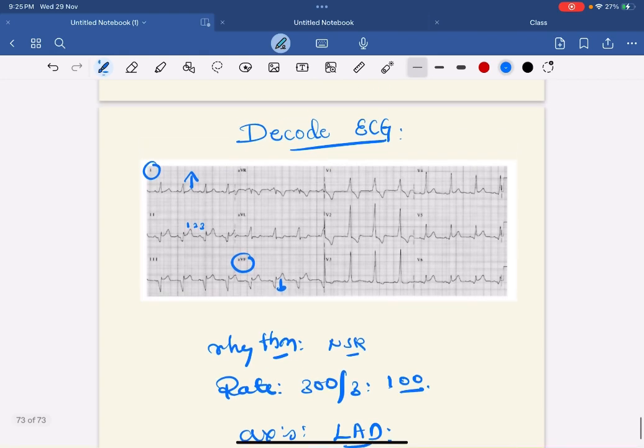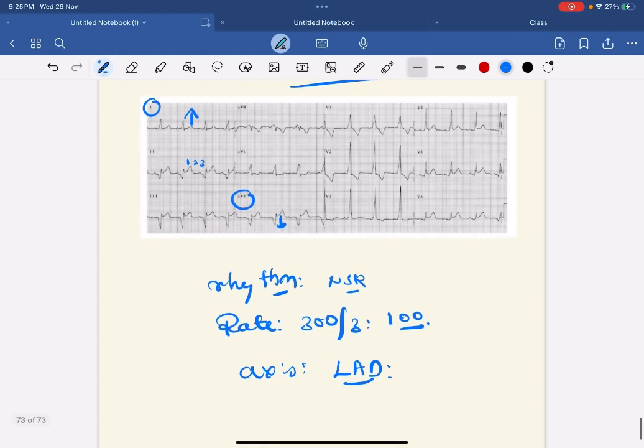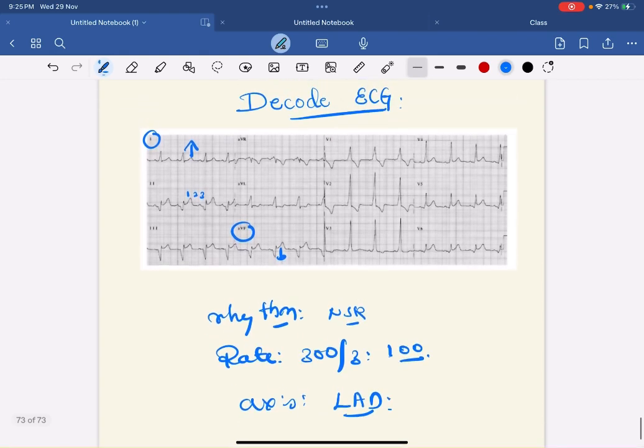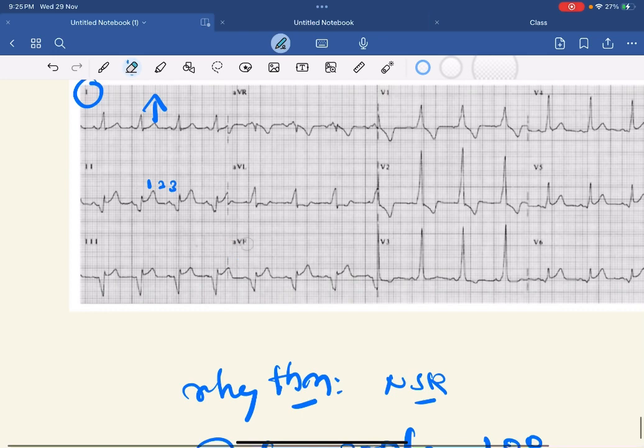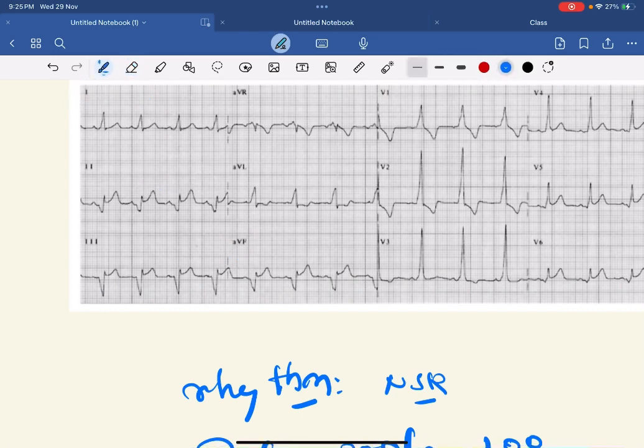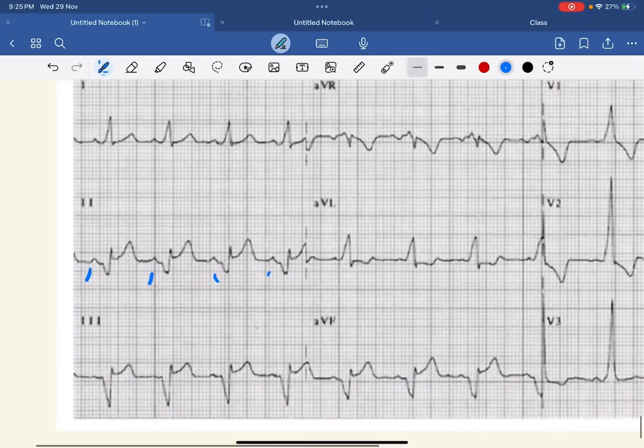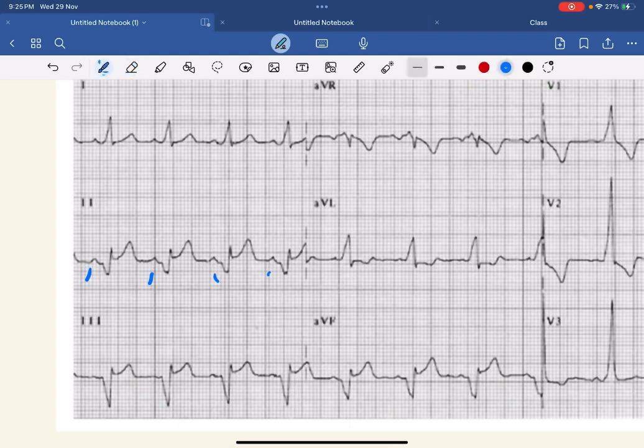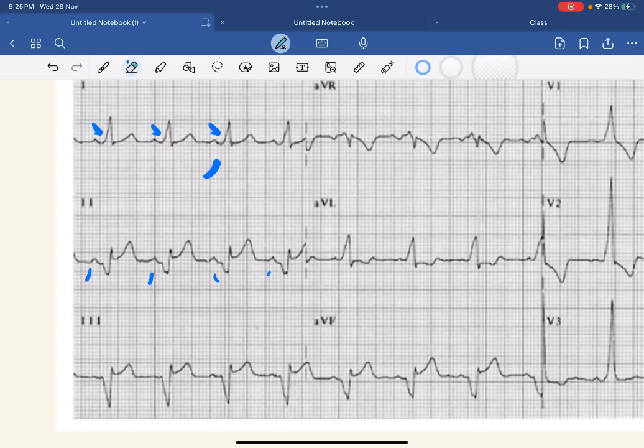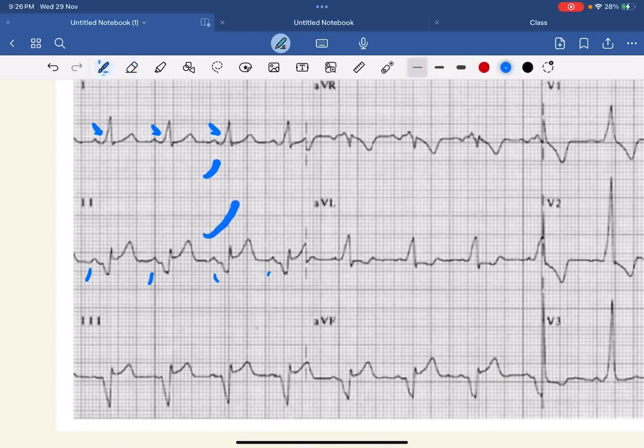After that you have to comment on waves. P waves are normal. What happened to QRS? Look at lead I. See the PR interval - it's only two and a half, so it is short PR interval. And what happened to QRS? See the initial part - there is a slurred upstroke like this. So there is short PR interval with slurred upstroke.